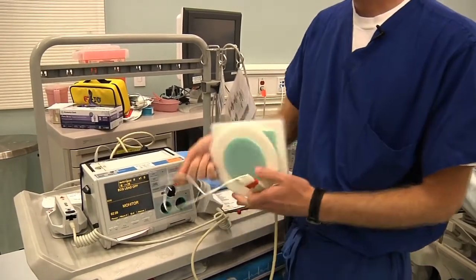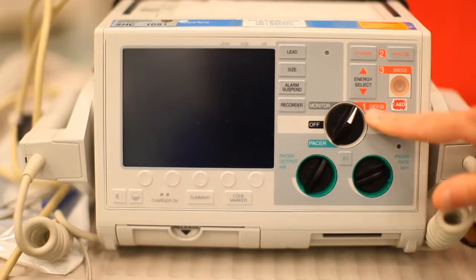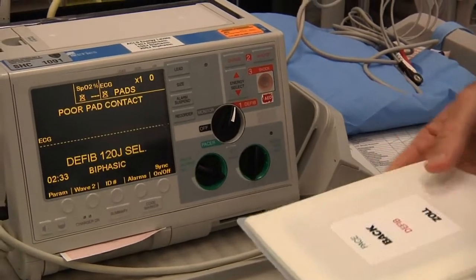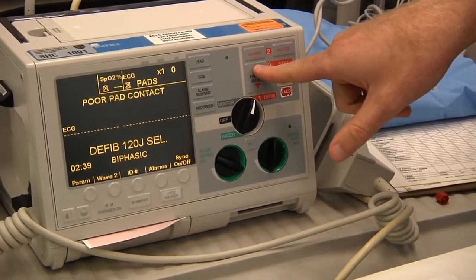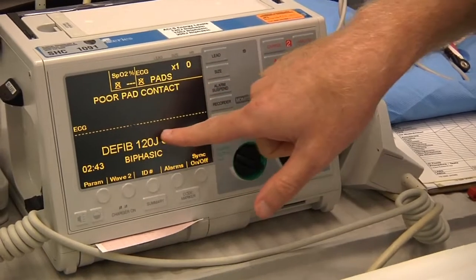So now I'm able to connect these. I'm then going to go to the defibrillator. Check pads. Now obviously it's not connected to the patient, so I was saying check pads. If these were connected, it would give a better contact. And then you're going to select the energy. By going up or down, depending on what it's set, it's right now defaulting to 120 joules.